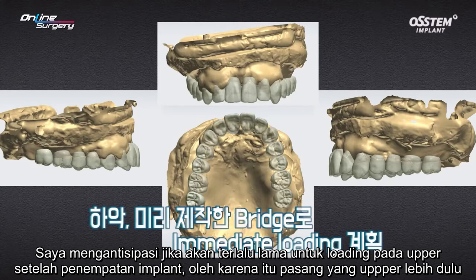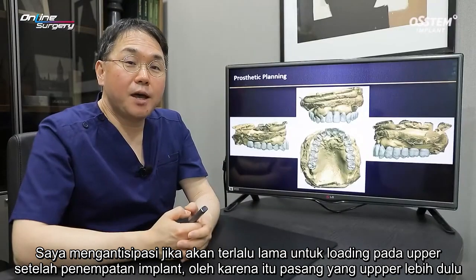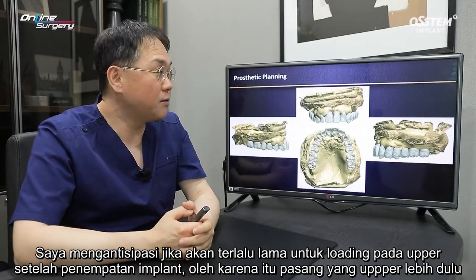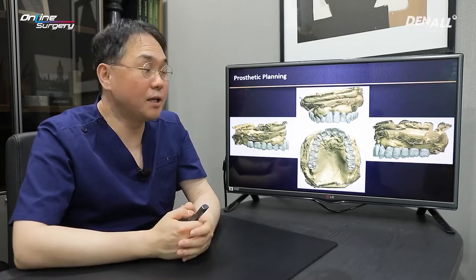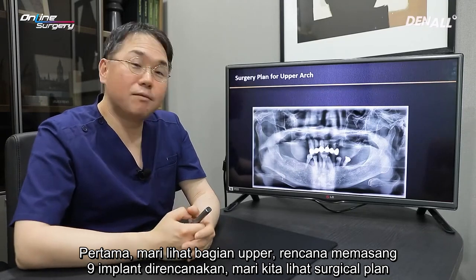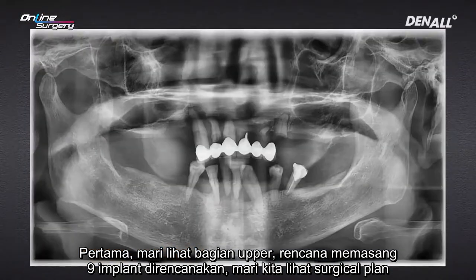I anticipated that it was going to take more time for loading on the upper after implant placement, therefore the implant was placed first in the upper. First, let's look at the upper. 9 implants were planned. Let's look at the surgical plan.